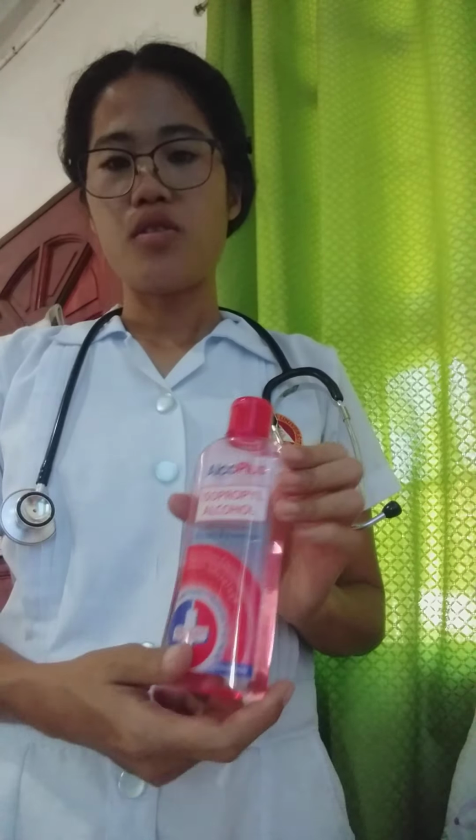First, we have to review the client's records in order for us to know how much oxygen we will administer to our client. And then we have to wash our hands using soap to prevent infection, or use alcohol.